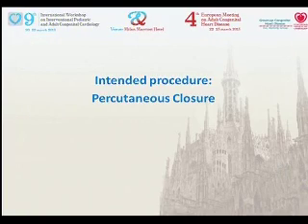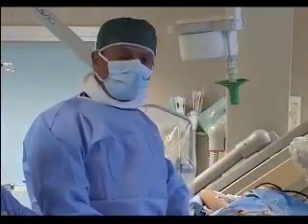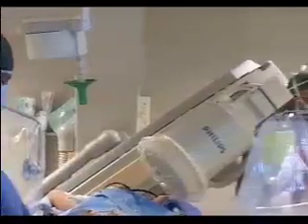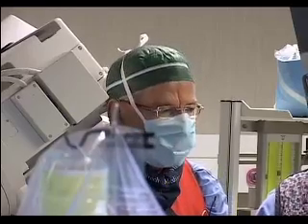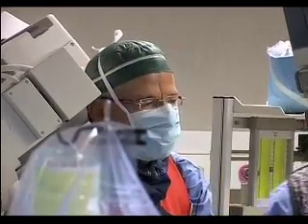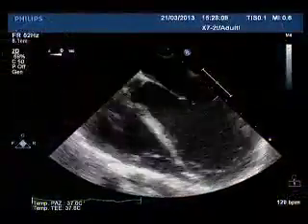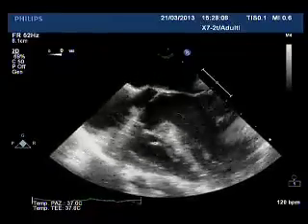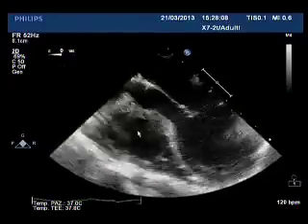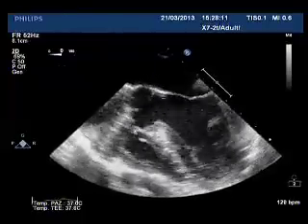So let me introduce also Dr. Ludomirski. Achi is from New York, and he's going to tell us about the echo findings by TEE. Achi. So thank you. As we can see here, and I agree with Carlo, practically the transesophageal helps us a little bit. Can they see the echo images? Yeah, thank you. This is the equivalent of a four-chamber view. You see the outflow tract and the aortic valve, and the VSD is in this area. We'll clear it up a little bit better, as you're going to see here.